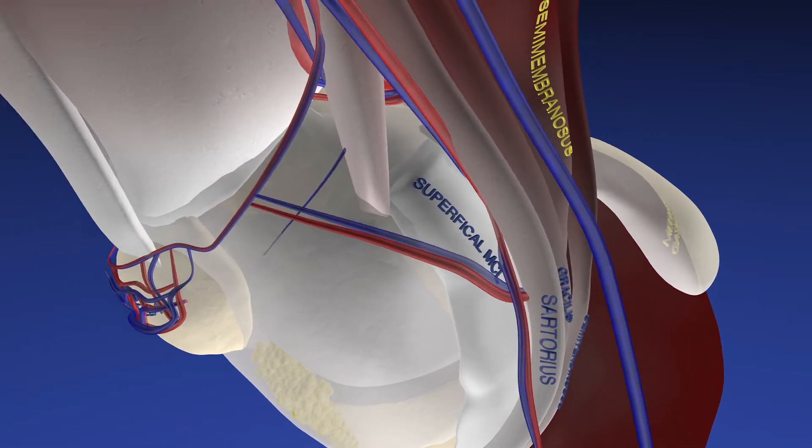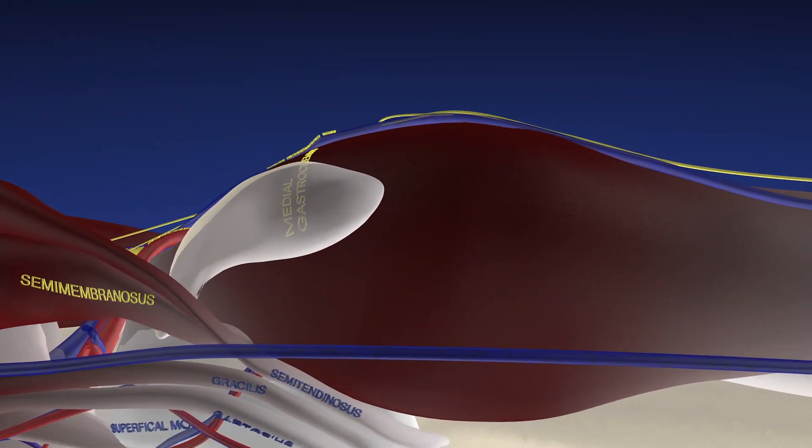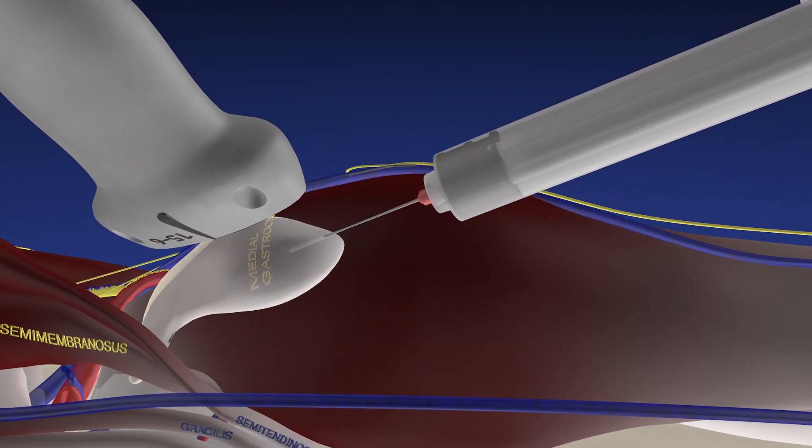Here we're going to go through the procedure where we initially drained some of the cyst, then performed needle fenestration, then drained the rest of the cyst, and finally injected with cortisone.